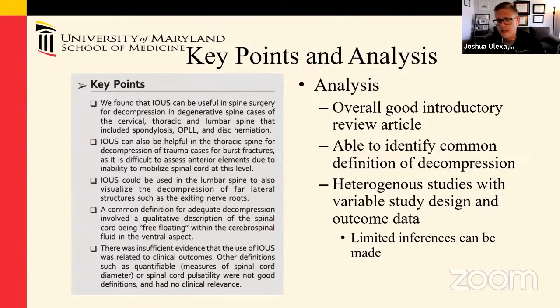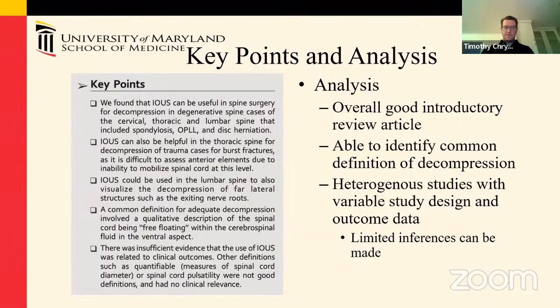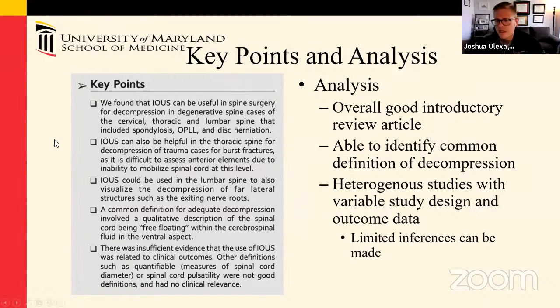And in this case, they're really, again, defining kind of a qualitative description, kind of how it looks in that CSF space. Based on all the papers, there's still insufficient evidence to suggest that using intraoperative ultrasound would give you any idea on how their clinical outcome will be later on. So overall, it's a good introductory review article. I think it highlights a lot of the points that we'll talk about further in this talk.